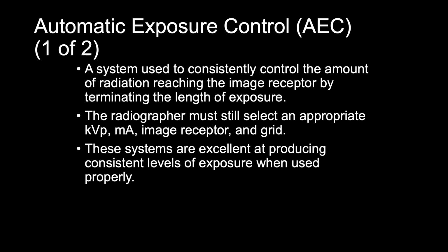The AEC device determines the exposure time, so we don't have to really worry about the exposure time because the AEC does that for us. The AEC system is excellent at producing consistent levels of exposure when used properly. The radiographer should also be aware of the technical limitations of using an AEC system.